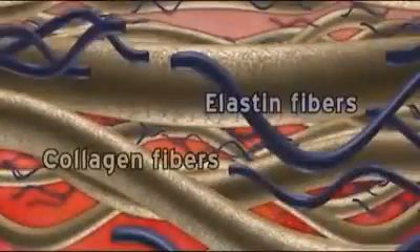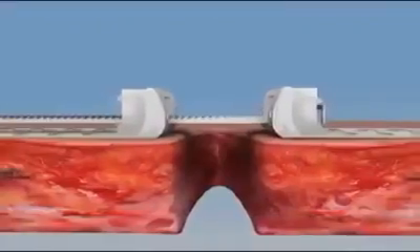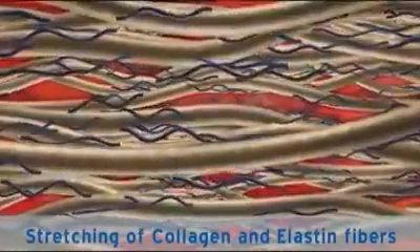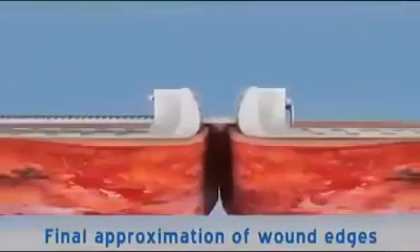The elastin and collagen fibers in the dermis are naturally coiled. During skin stretching, the elastin and collagen fibers stretch and align according to the stretch direction until final elongation is reached when wound edges are approximated.